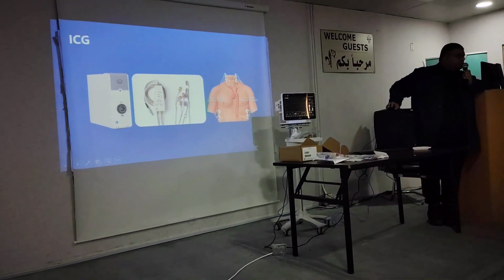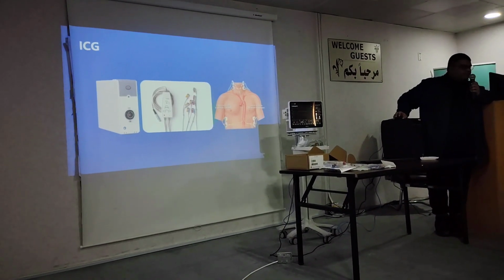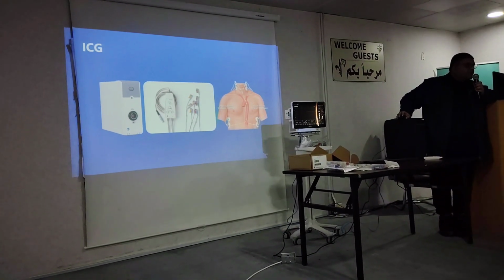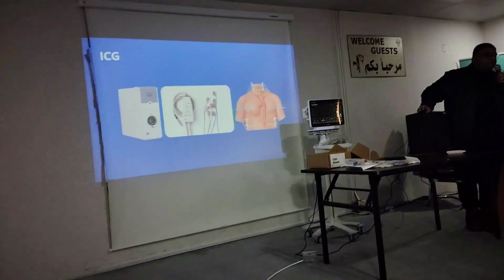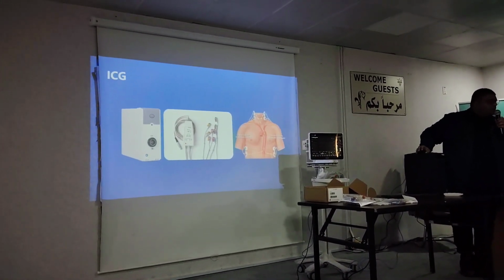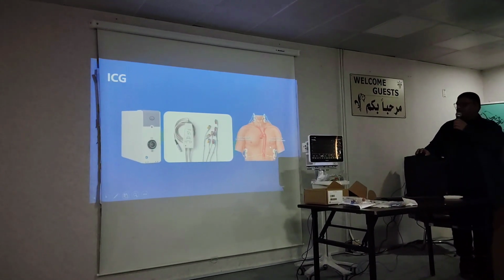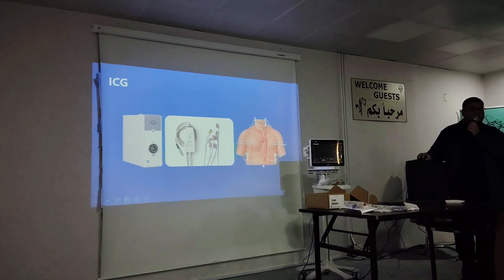Okay, who knows this one? Yes, this is very easy to use. It's a non-invasive cardiac output monitoring device. If you're trying to monitor someone's cardiac output, in the CCU, surgery, ICU, ER, or wherever you have cardiac patients with decreased cardiac output, you can use ICG, and this will non-invasively detect your cardiac output.